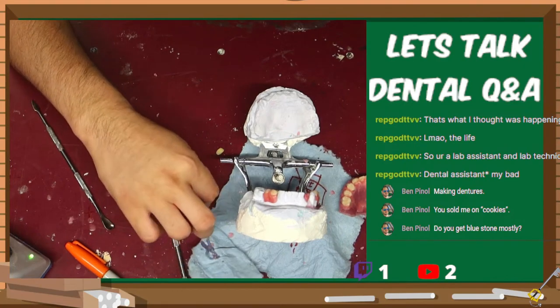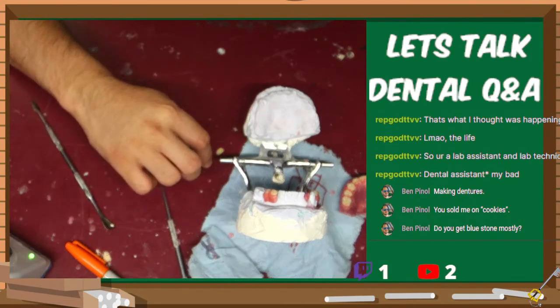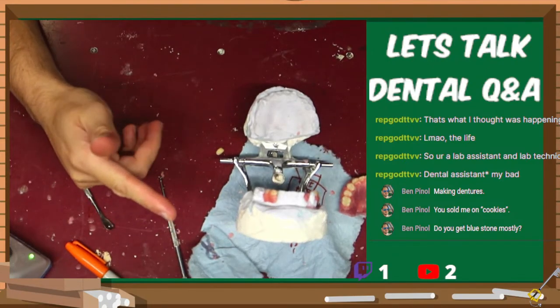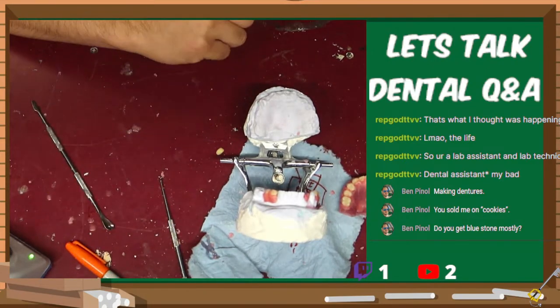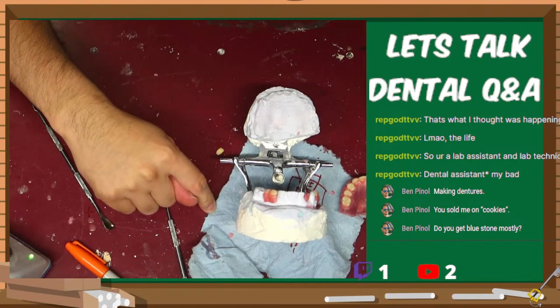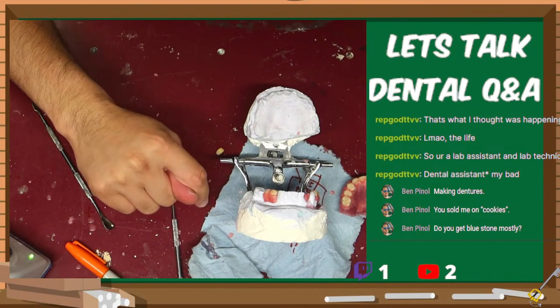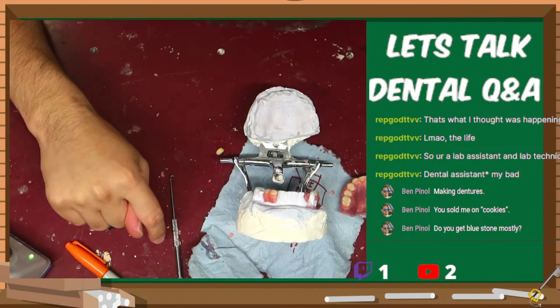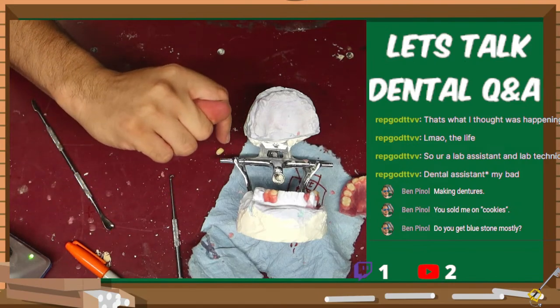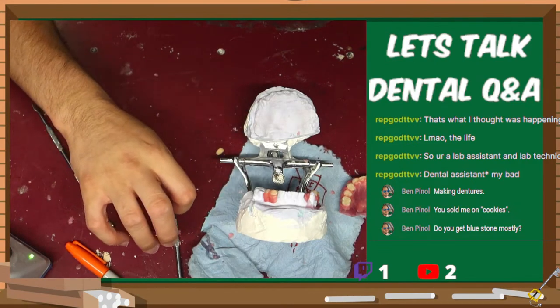So if I get an impression back or a pour-up or a model and it's not blue or white, I know it's not from me and someone else poured that up. So I know I can blame someone else. It's like, oh, I have a Yellowstone model here. More than likely your assistants poured it up and it looked like crap, so I know who to blame for that pour-up.